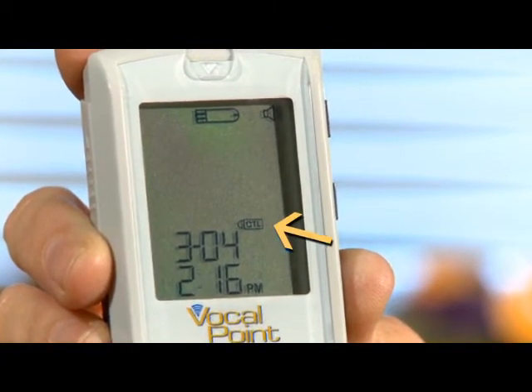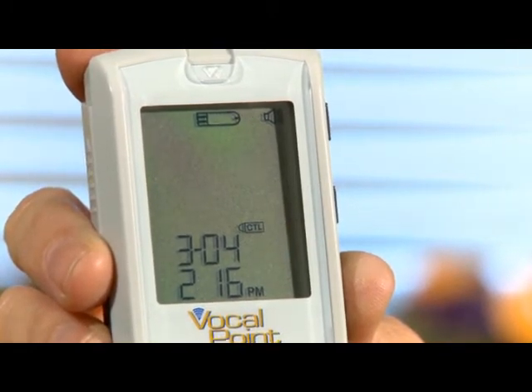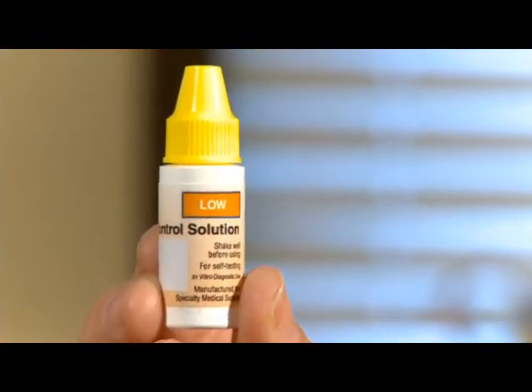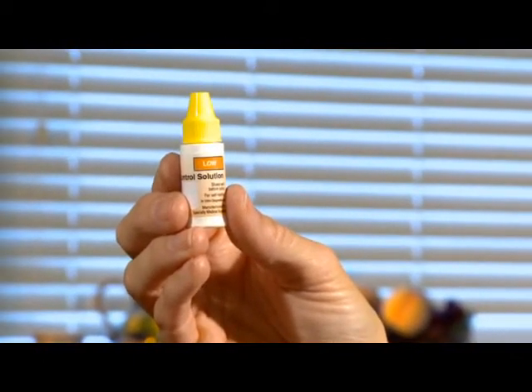CTL indicates that you'll be taking a control solutions test and the control result will not average into your glucose readings. Verify which control solution you're using. For our demonstration, we're using a low control solution which has a yellow cap.